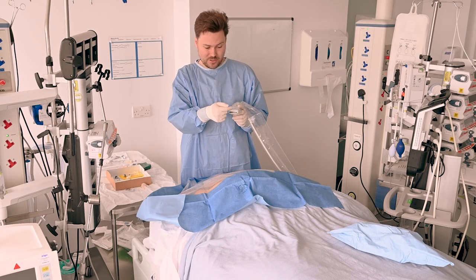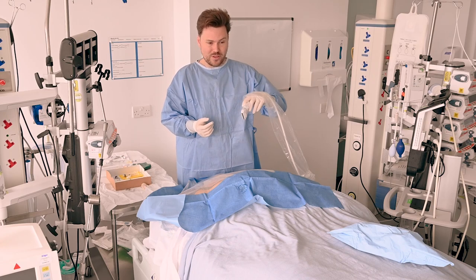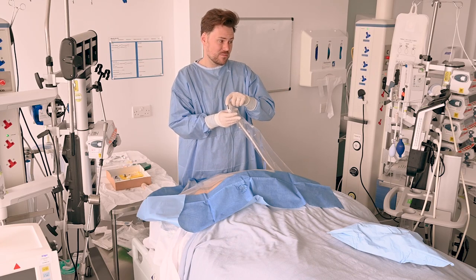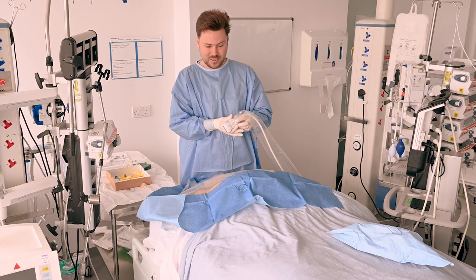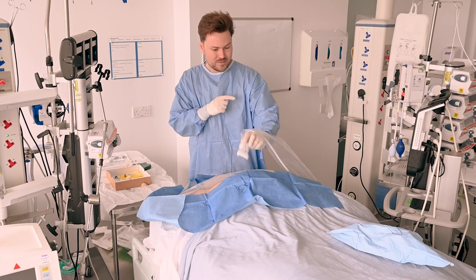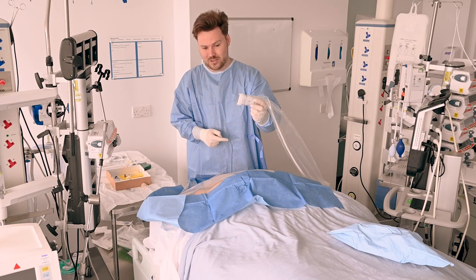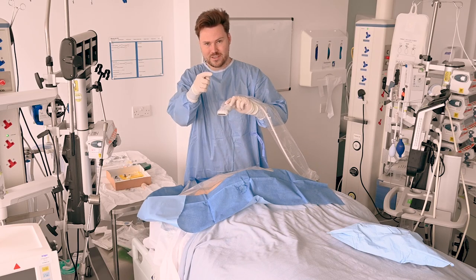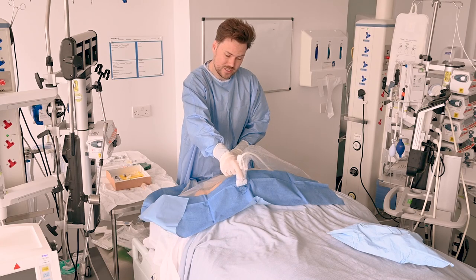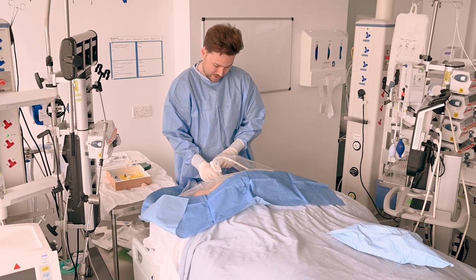A quick tip to figure out which end of the ultrasound is the correct end and whether you should be holding it one way or the other: rather than pressing on the end, which you can do but you end up with jelly on your finger, is to dip one corner in and have a look at your screen. I know that this is the right way around so the left hand side with the buttons facing out will correspond to the left hand side of the screen. And if you need any more ultrasound jelly it's easy to just dip it in the puddle.